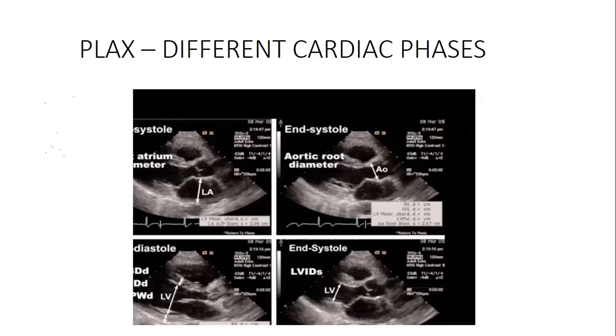These are just different cardiac phases, which I won't explain because I wanted just to show what is happening here. This is in end diastole, okay? And then this is in systole. But I want you to notice that in systole, like I mentioned, the myocardium contracts because systolic simply means cardiac contraction. So it thickens here.